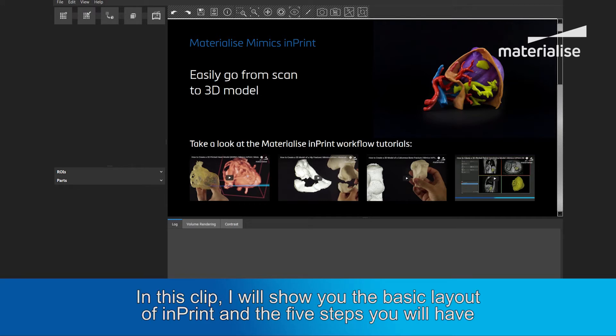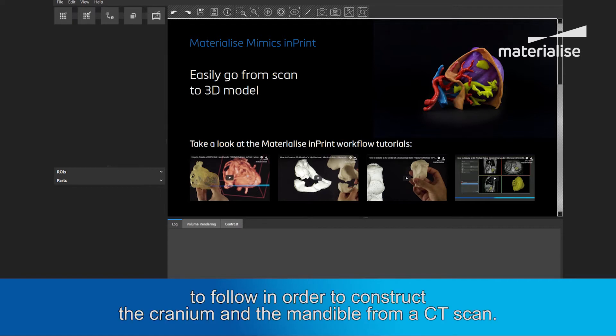In this clip, I will show you the basic layout of inPrint and the 5 steps you will have to follow in order to construct the cranium and the mandible from a CT scan.